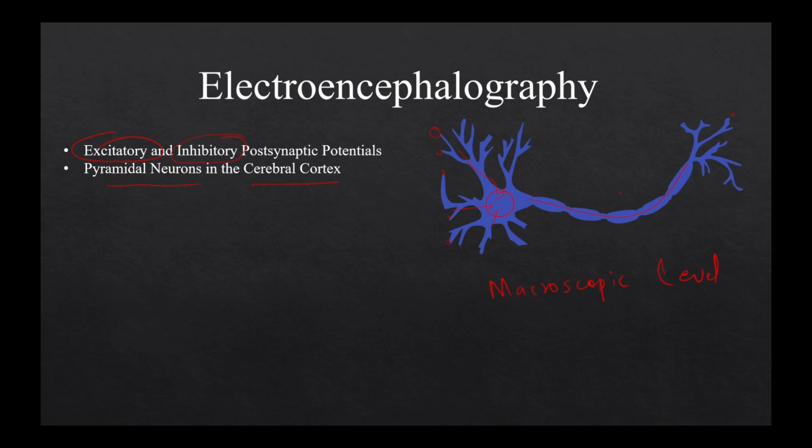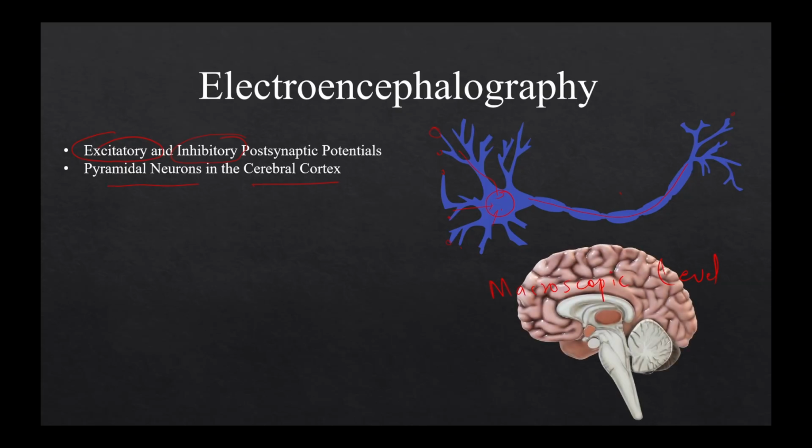In EEG, we mostly measure the brain activity of the cerebral cortex, meaning the surface upper layer of the brain, if you can say. It's not possible for EEG to know the electrical activity of the deep brain. So this is mostly surface level. These are the surface layer. If you say surface level, this is the cerebral cortex. So here we measure the electrical activity.